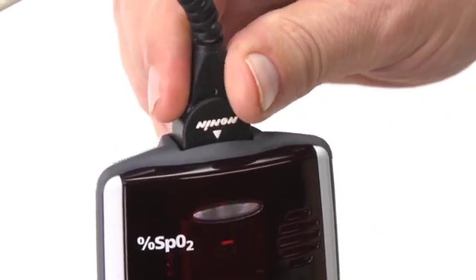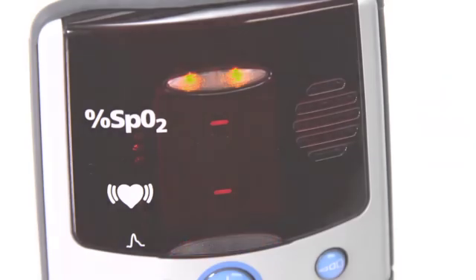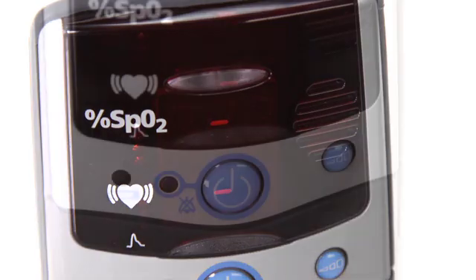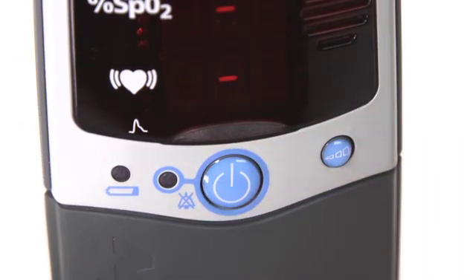Signal loss from the sensor is possible with hand or body movement, or disconnection of the cable. Signal can also be reduced by body position or cold conditions, which may reduce blood flow. The audible alarm will sound a 3-beep alarm every 25 seconds, and a dash will appear between the pulse and oxygen level displays. You can silence and restore the alarm with the press of the on-off button. Check and correct the position of the sensor if it has moved, and recheck the sensor connection to the oximeter.